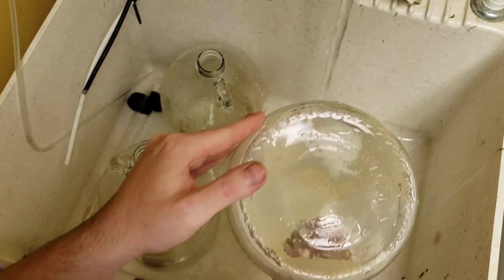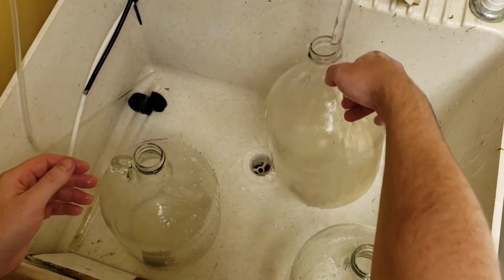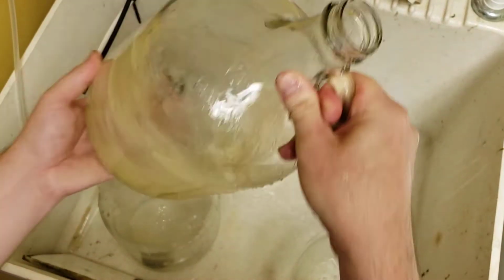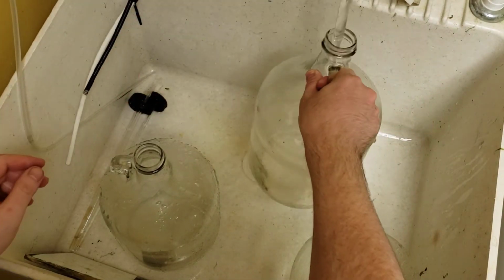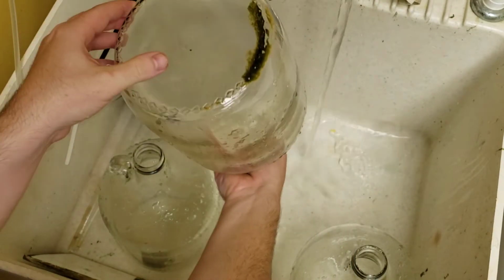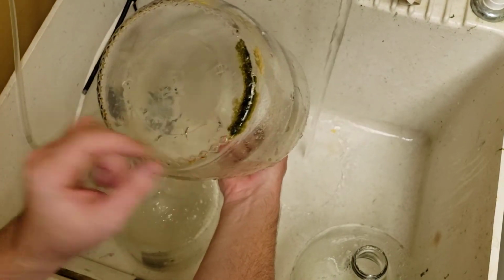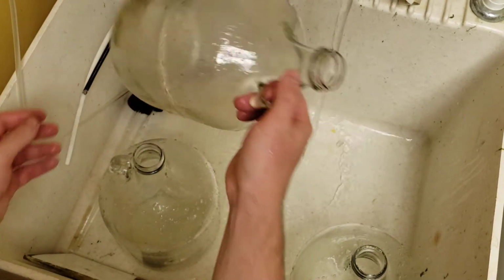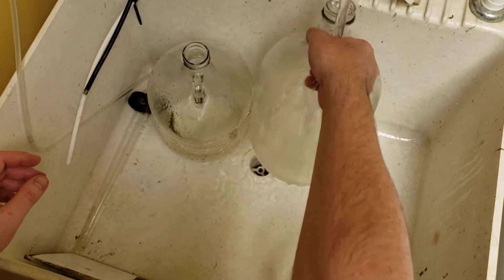This stage is just lots of rinsing. Get all that bleach out of here. You can see here that there's still some green algae, so maybe the bleach didn't get all the way through that, so we'll see how that cleans up with the acid. Might have to do that one again.